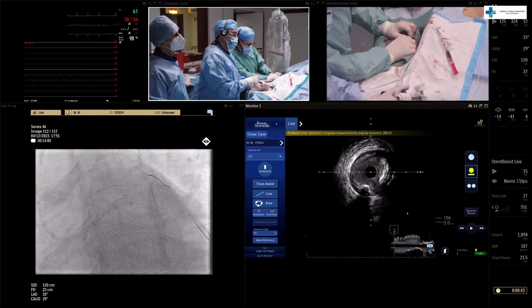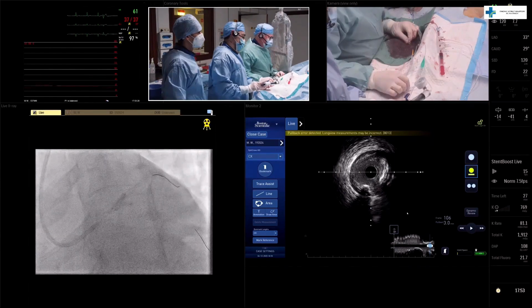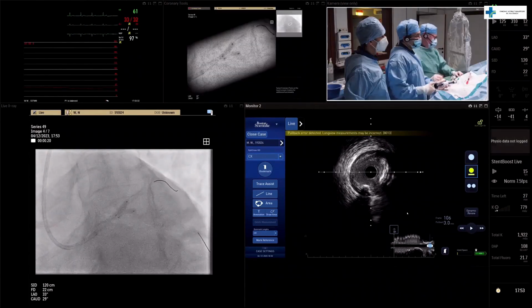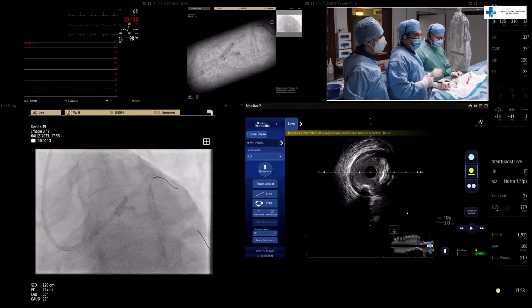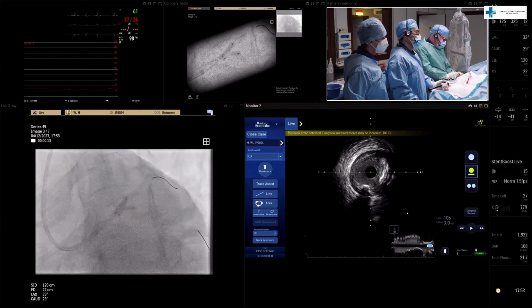Okay, we have 6:45, it's enough. Deflate. Okay, this is final kissing for me. 308, 6 atmospheres, deflate. And we will now repeat.